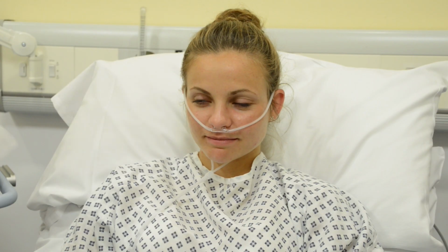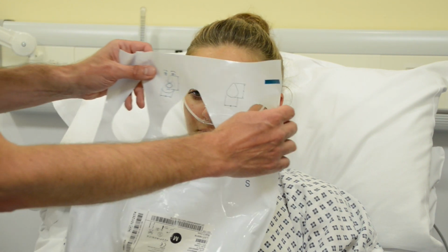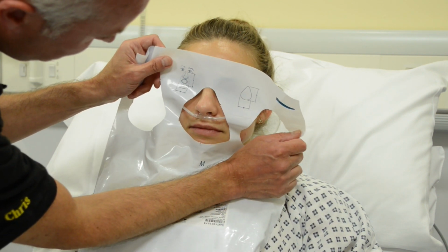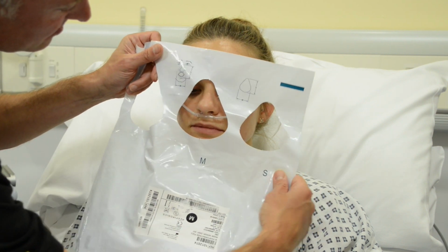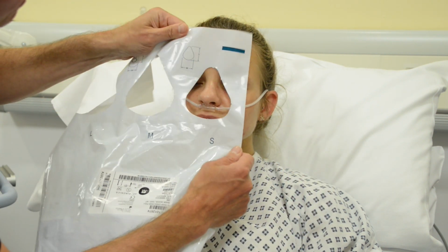To measure for an oronasal mask, hold the sizing guide found on the bottom of the mask bag up to the patient's nose and mouth. Check the top edge rests on the bridge of the nose with none of the eye area appearing in the cutout. The bottom edge should rest below the bottom lip and above the chin.